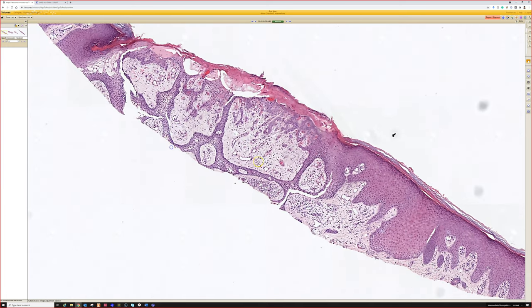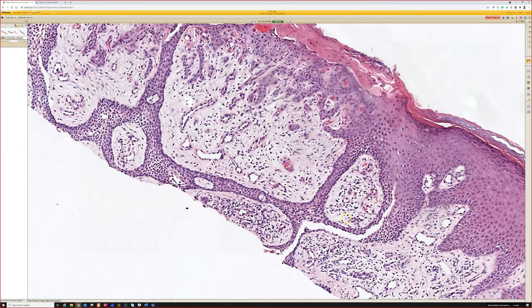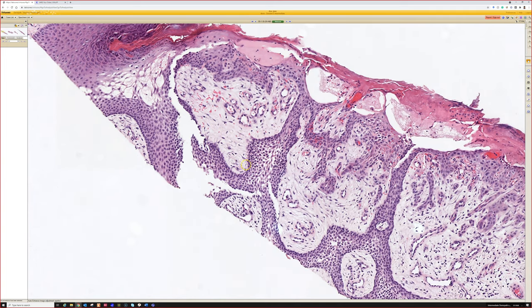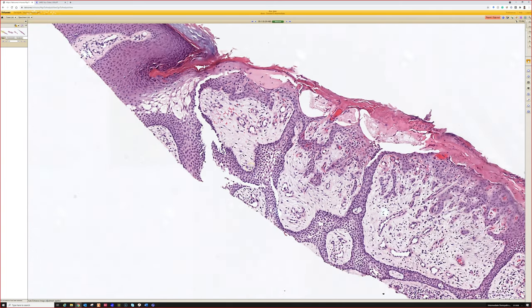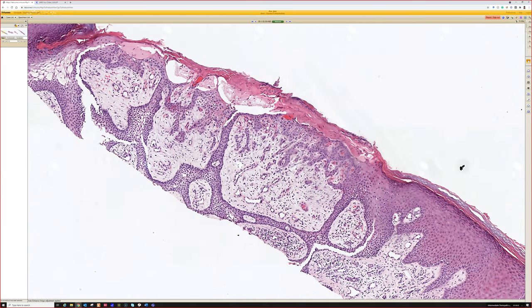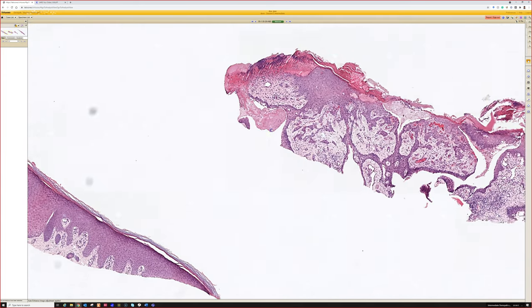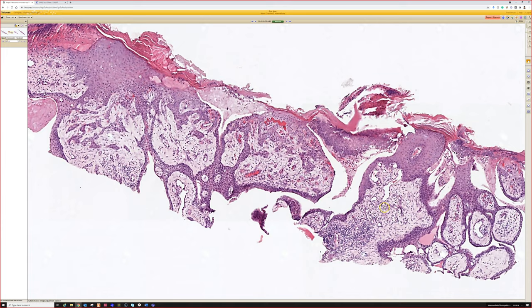They have elongated, thin strands coming down from the epidermis that get really long and thin, and then they anastomose and interconnect. And then in the middle of those strands, there are sweat duct spaces. I like the acrosyringeal nevus name because it points out these are basically a bunch of acrosyringia that have grown really long and fused with their neighbors. And here it's ulcerated. And then they also have a lot of fibrosis and reactive changes in the stroma.